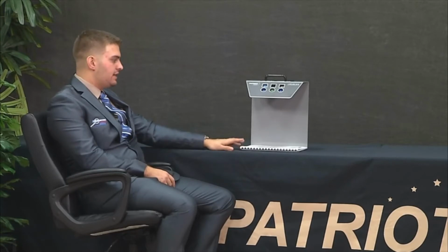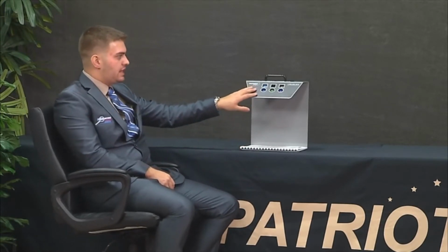After the picture is taken, you're going to hear a shutter sound here. After that shutter sound, it'll take about 7 seconds or so to start reading out loud the document. I'm going to be able to walk you through what the buttons are on the top as well momentarily. So it's playing a ticking sound right now.